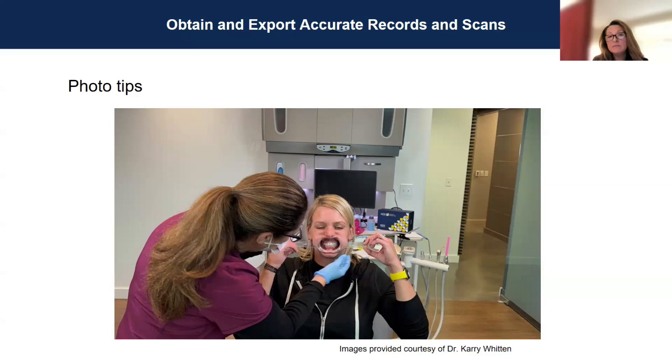But that helps to verify if it is definitely a skeletal case. So you would know if it is a more complex case that may take longer, and you would want to steer clear of that until you have mastered clear aligner therapy.